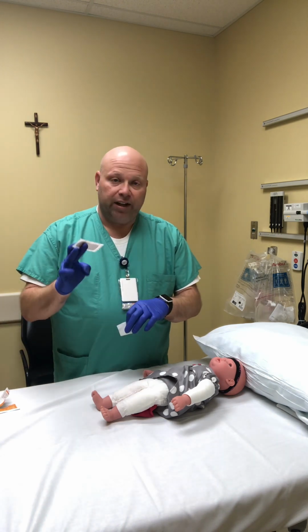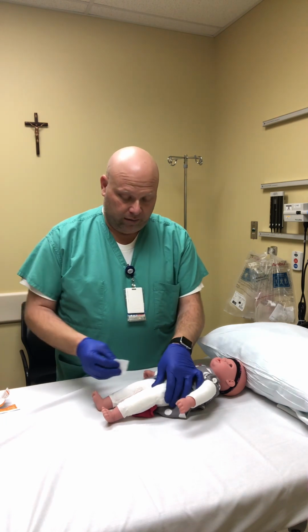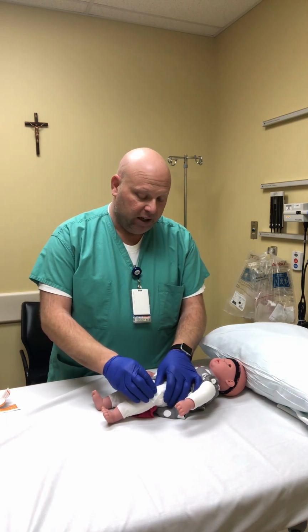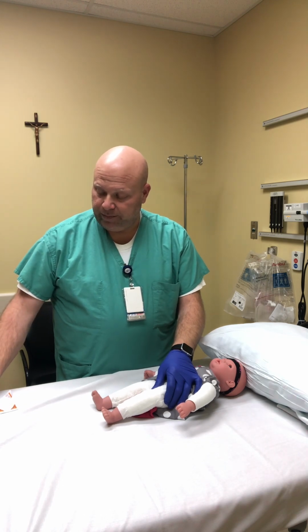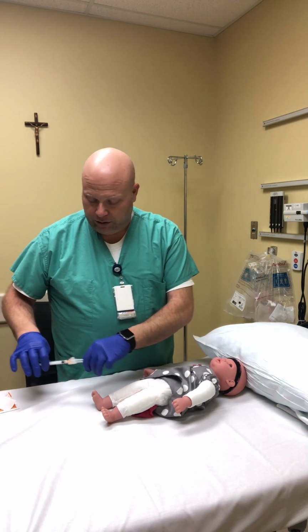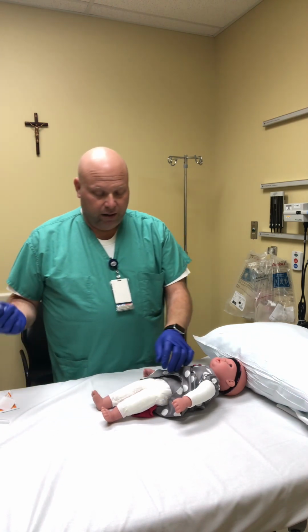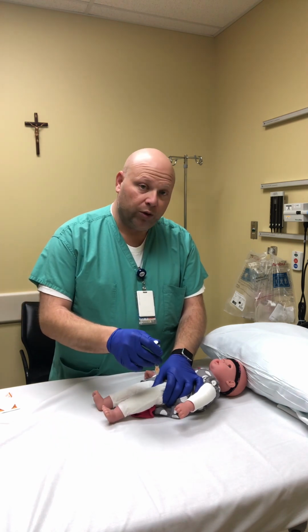I would get my Band-Aid and have it ready on my hand, but I'm not going to open it up just because this is a baby doll. So I'm going to clean the site really good. I'm going to let it air dry. I'm going to remove my syringe with my needle. Now, I'm going to do an IM injection.